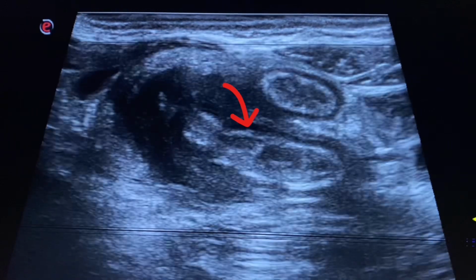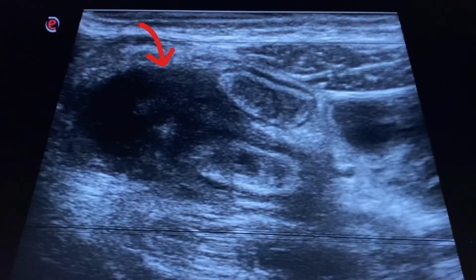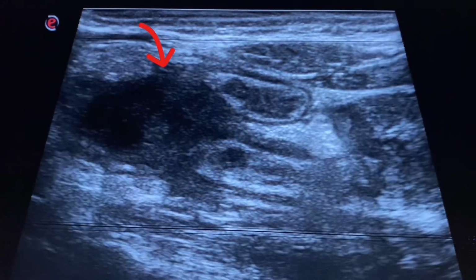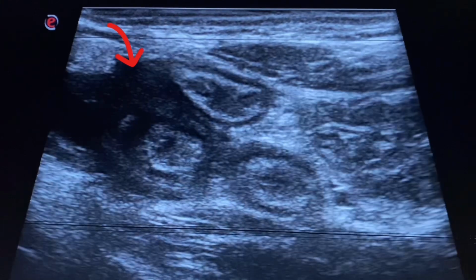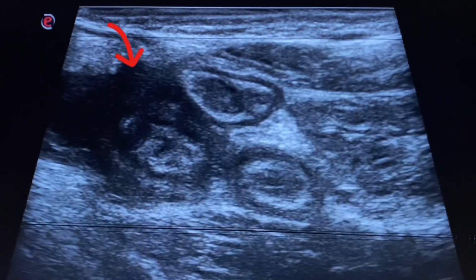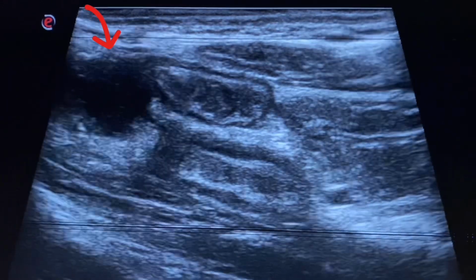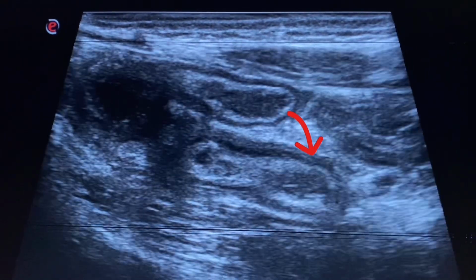We see no peristalsis in this lumen, and the proximal part is swollen and shows heterogeneous texture. And this is distal end.